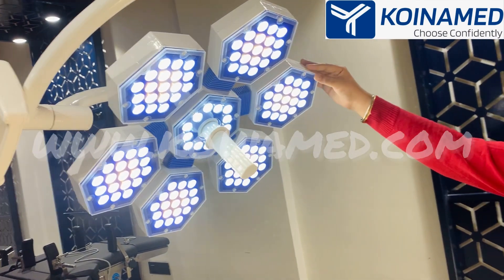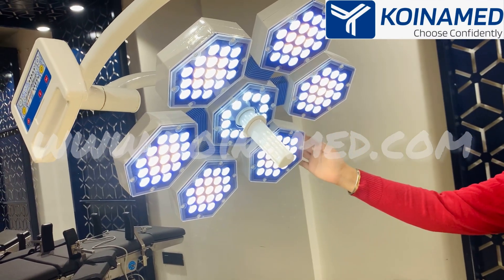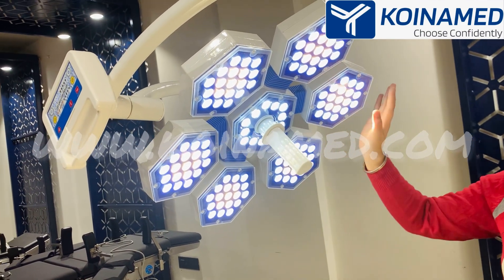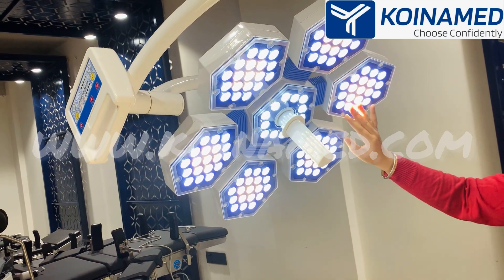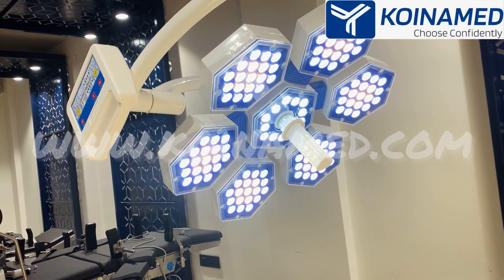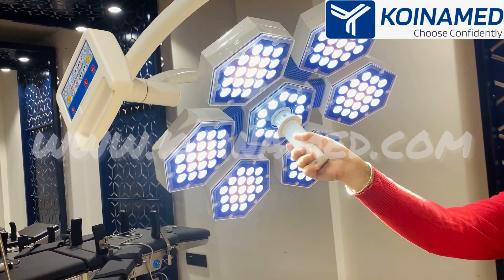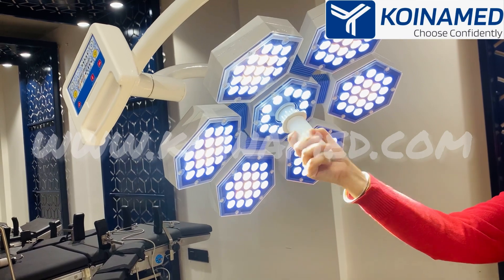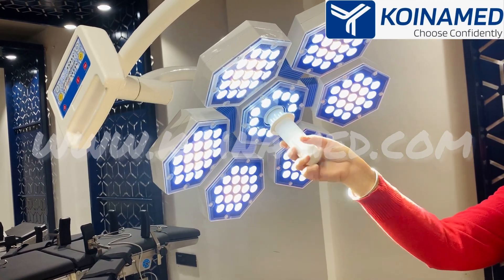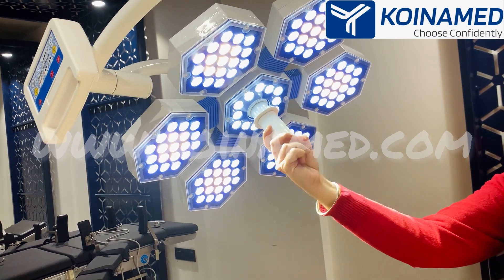In this dome we have provided a hexagonal shape with a blue base to make it more attractive. We have also provided ESD safety glass that makes the LEDs scratch proof and dust free. In the middle of the light we have provided a sterilizable handle for adjusting the focus.